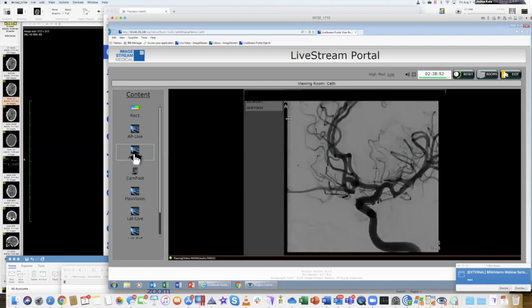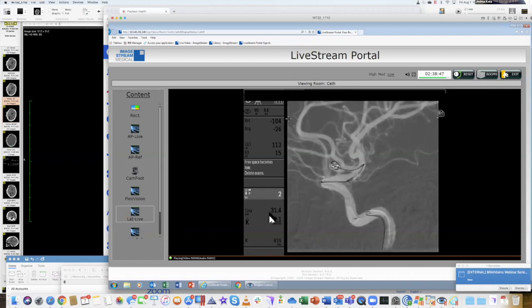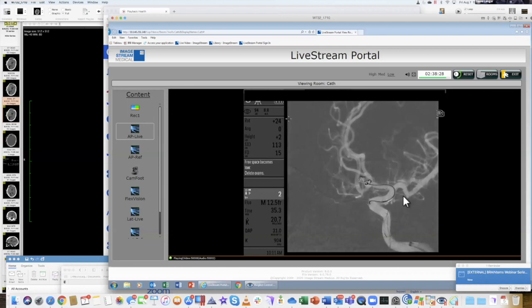People are wondering, is there something holding the coil in place once you leave it there, and does it stay there forever? It stays there forever. Here's a different view. So now he's advancing. You can see the catheter wandering around inside the aneurysm. I think he has a better coil position now, with the other view. Now that coil's coming out again, so he pulled it back.